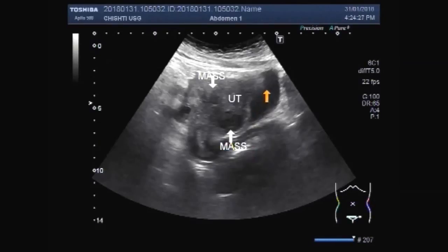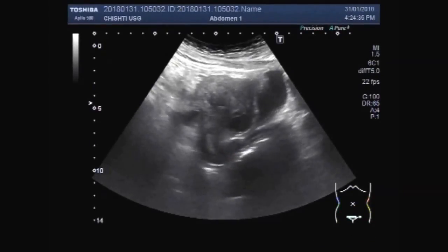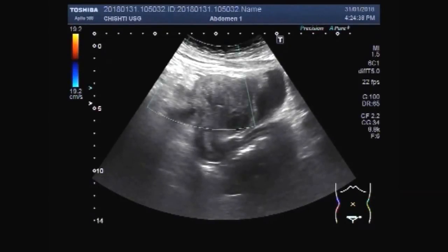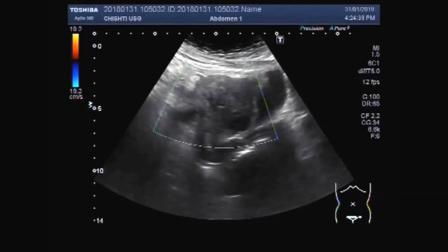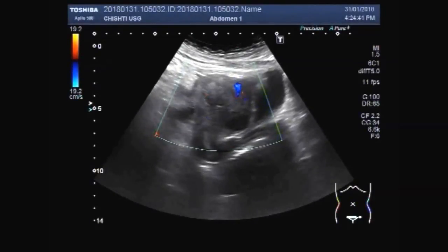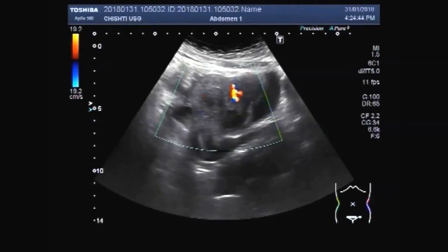This is the urinary bladder and cervix. Now you can see both the fibroids. A fair amount of blood supply is also seen.